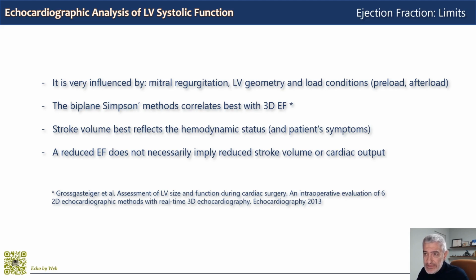The answer is no, it is not sufficient, for a purely methodological reason, or rather for a reason of quality of work. If you limit yourself to measuring biplane ejection fraction only in a few of your patients that really need it, with a severe reduction in a cardiomyopathy, for example, you will never achieve optimal accuracy and reproducibility, which requires long-standing experience and mostly constant commitment, like an airplane pilot, who bases his experience on hours of flying.